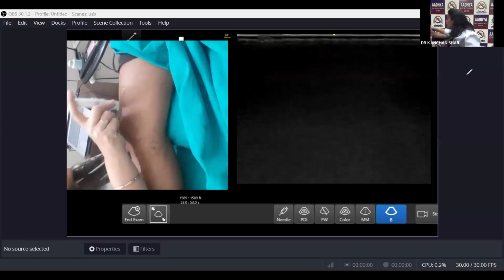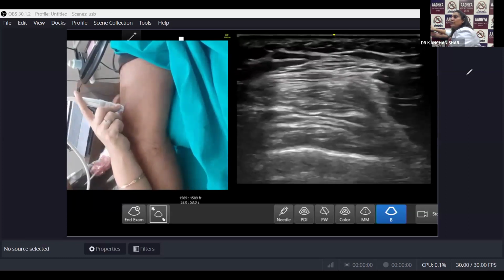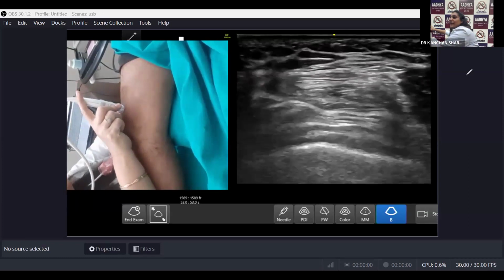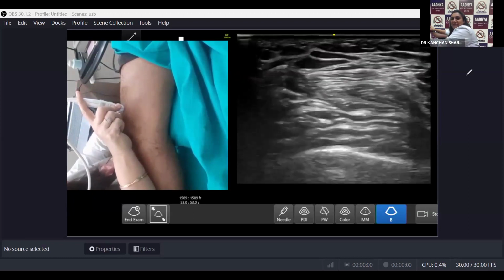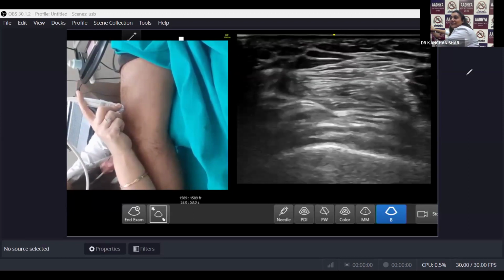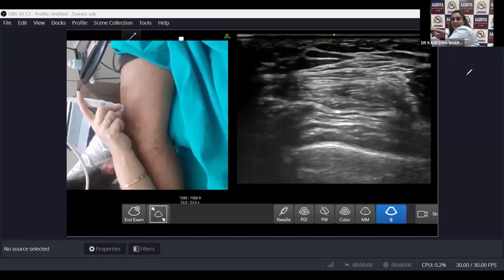The third one is, again, you put it here and you try to poke from the lateral side. Okay, see, your fat pad will be dancing. They're dancing. This is not my technique. Okay, I read it recently somewhere. So the fat pad will dance, but the tendon will stay. Are you able to see?